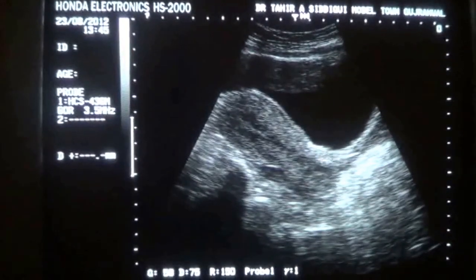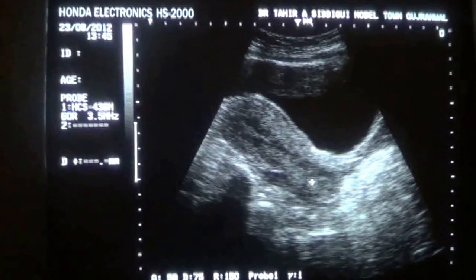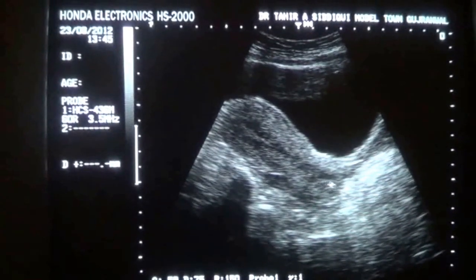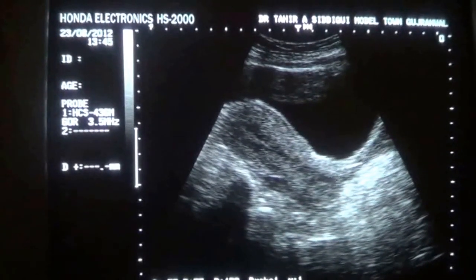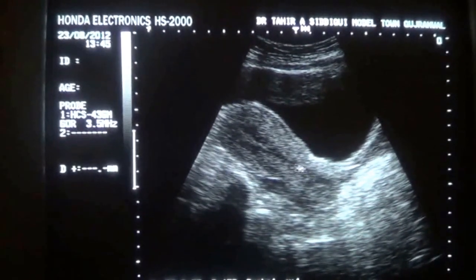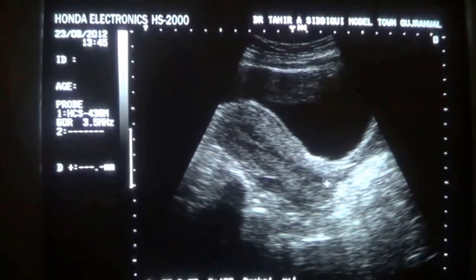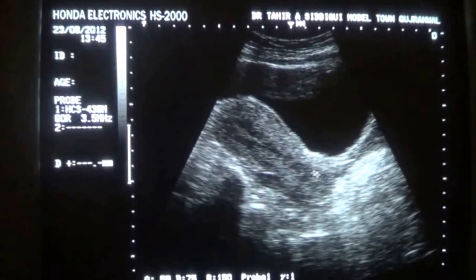This is the cervix, anterior lip. This is the posterior lip of the cervix. This is the vagina. This is the endometrial canal. This is the cervical canal.